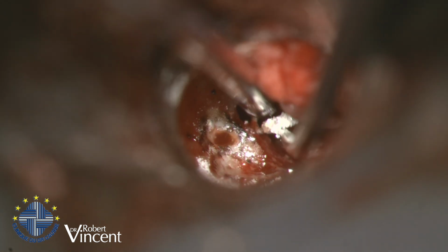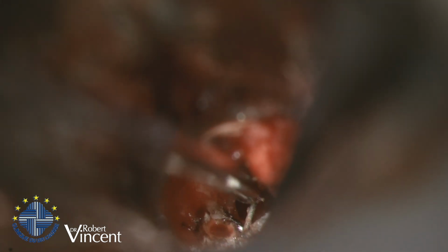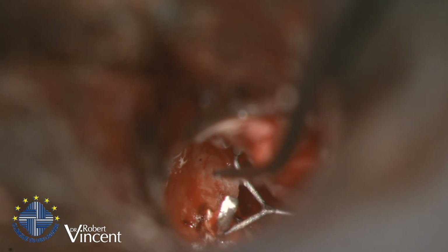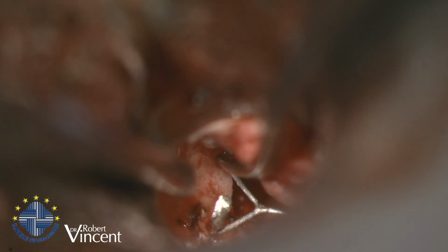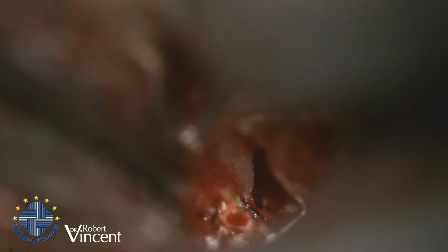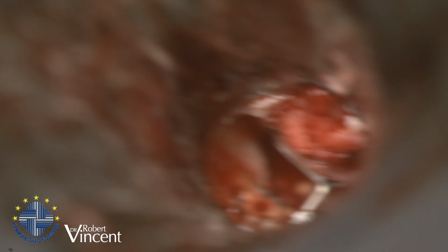Now we need to decide for the second one, which will be, I need to place it closer to this. Otherwise the handle will be too short, so I need to decide for the position. Yeah, that's it. Now we need to place it here. I need to make it here. Very narrow, to do. Yeah, I try to find the right way to expose it better.